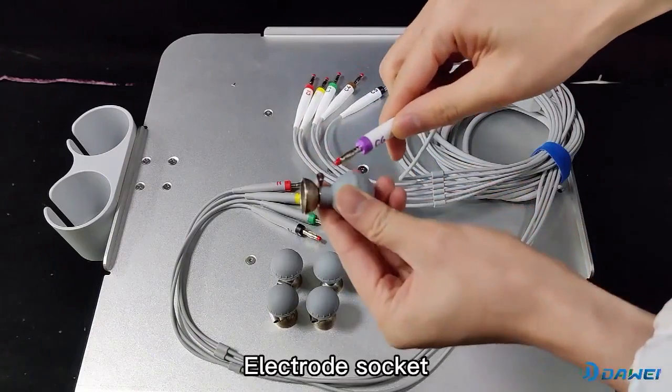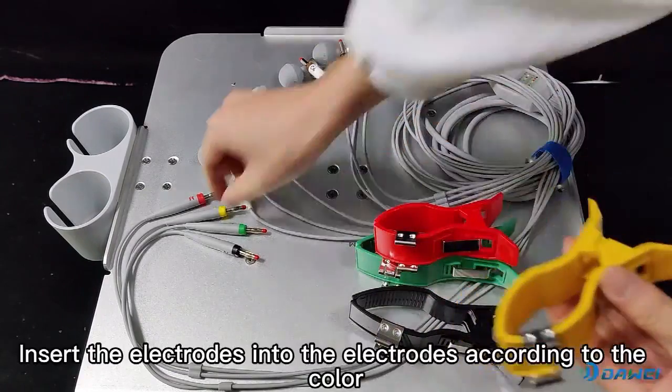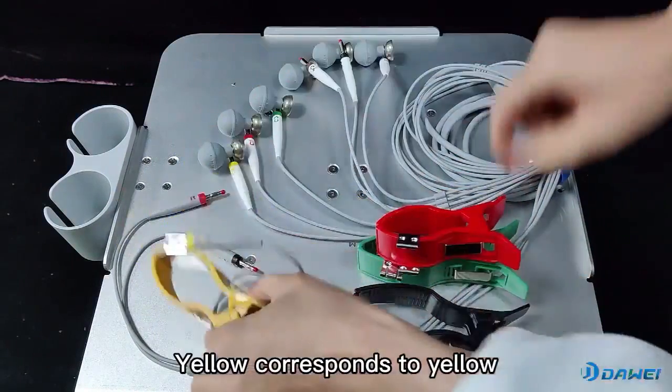Connect the electrode plug to the electrode socket. Make sure the electrodes are clean. Insert the electrodes according to the color. Yellow corresponds to yellow. Connection complete.